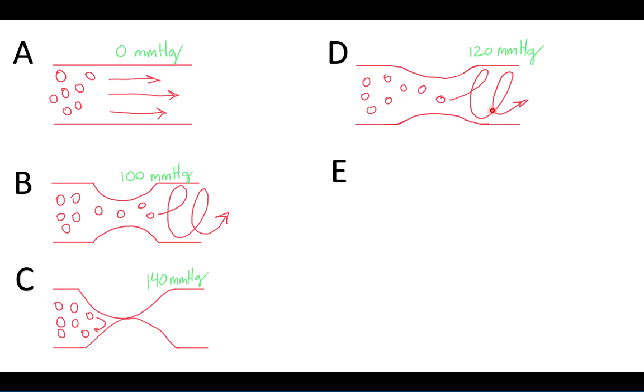As an example, I said that this patient had a blood pressure of 120/80. So if we get to 120, and this is where we hear our first sound, it's at this point that we would say that's our systolic measurement.